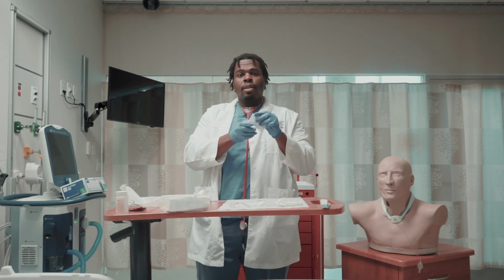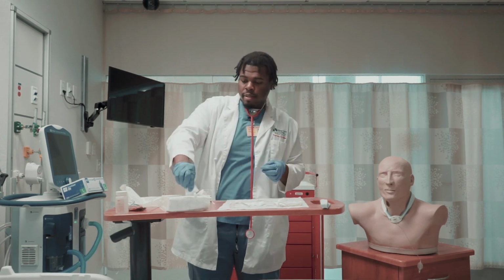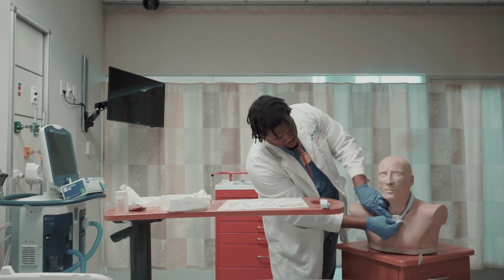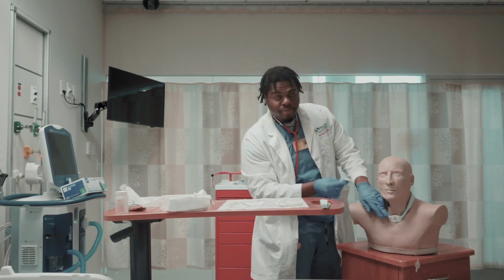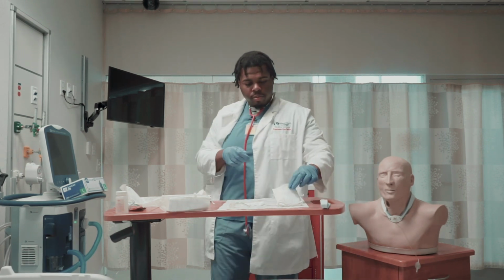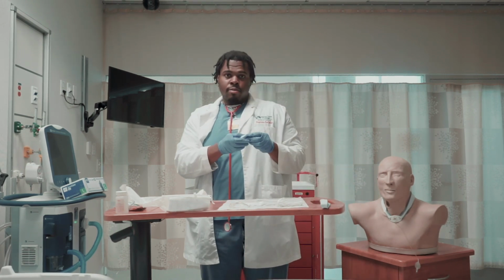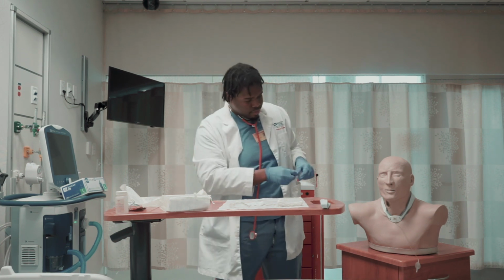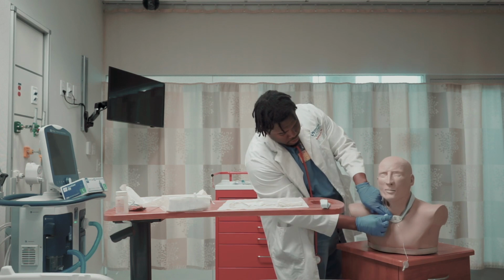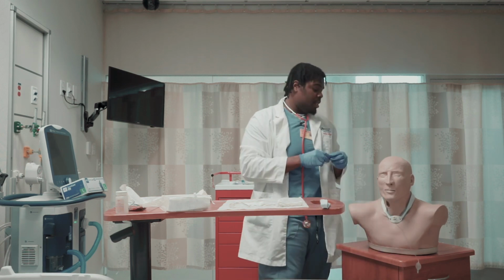Now I'm going to rinse. Dip it in the water. Go under one time. Garbage. Now I'm going to dry it up. Dry. Garbage.